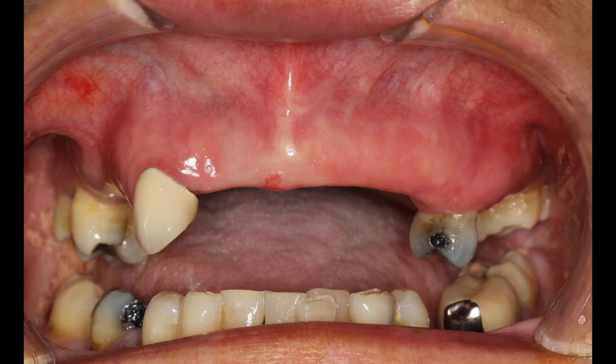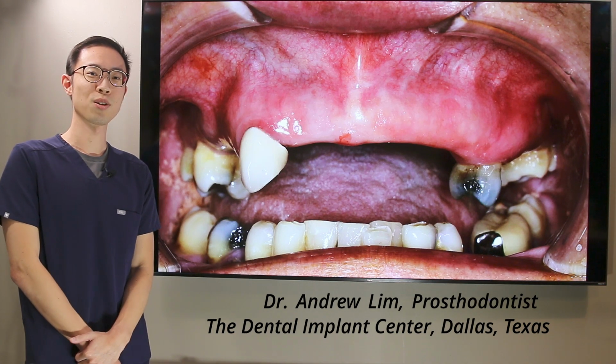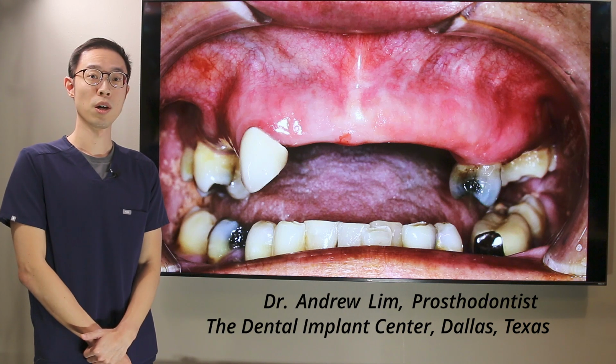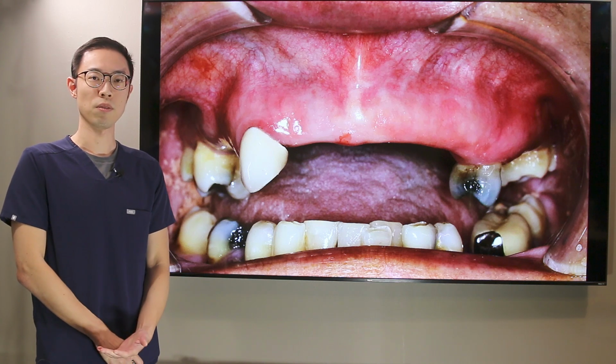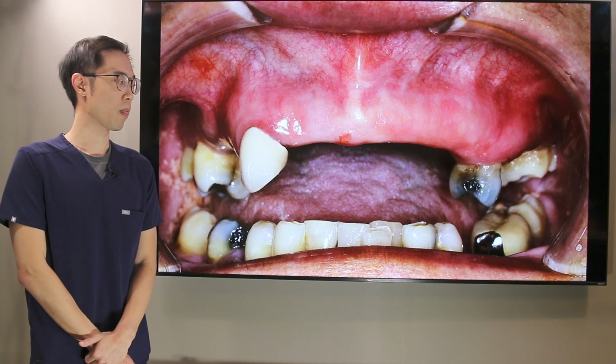So our patient today presented with multiple missing teeth and teeth that were not in great condition, and so we wanted to help the patient along. I think the patient also felt like she wanted something fixed, and she felt that implant treatment would be good for her.